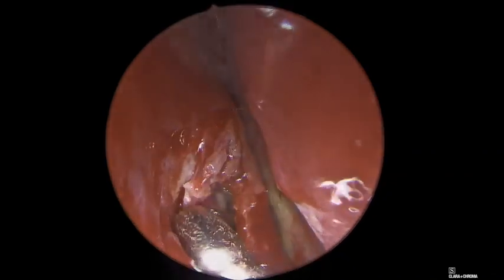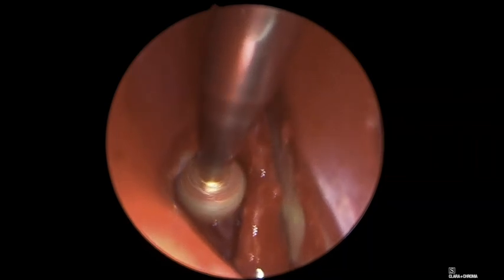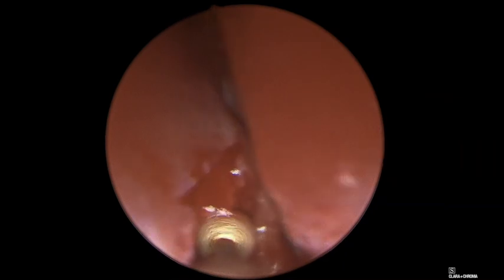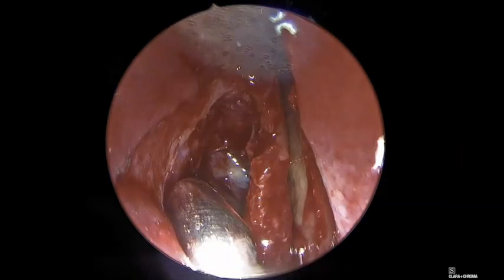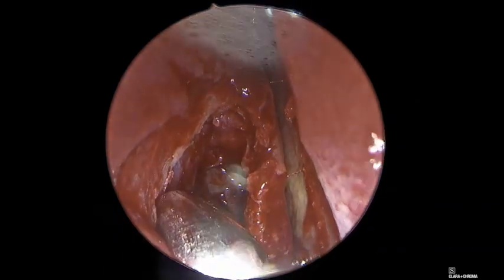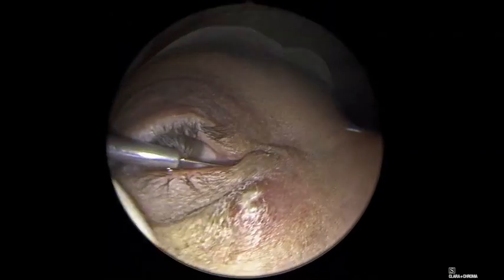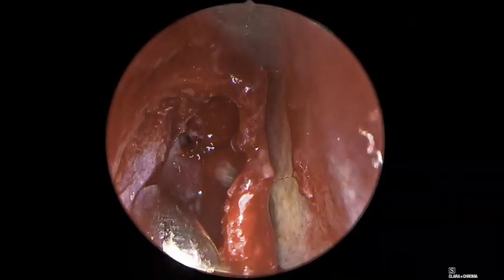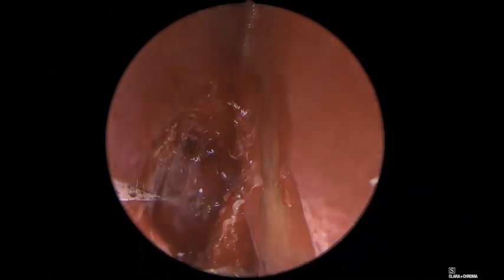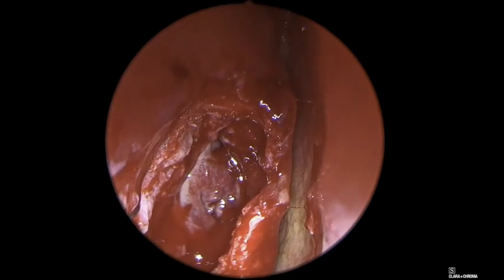At this stage, using a diamond burr and a 45 degrees angled scope, we proceeded to drill the lacrimal bone with a gentle craniocaudal motion. After proper drilling, an adequate exposure of the lacrimal sac may be achieved. Using a Baumann lacrimal probe, we confirm the projection of the medial aspect of the lacrimal sac onto the lateral nasal wall. At this point, the sac is incised using an angled beaver knife.